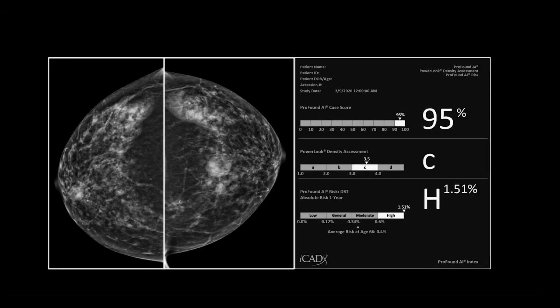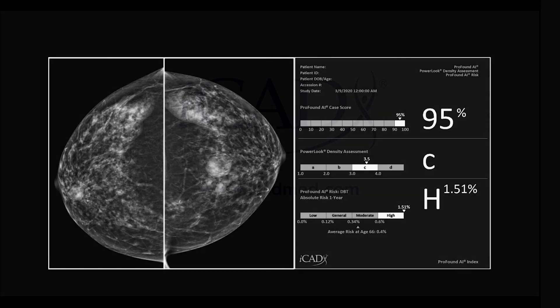This patient had high breast density — you can see a complex mammogram with multiple masses and patchiness — and she was considered at a high level of risk. For her, we recommend annual screening, formal risk assessment, and supplemental screening.